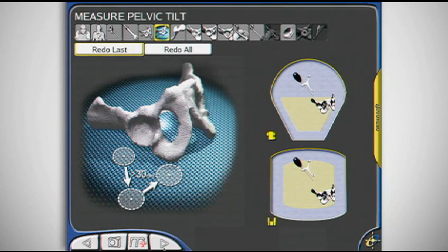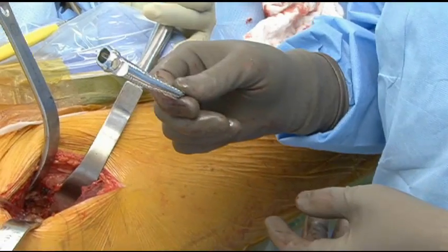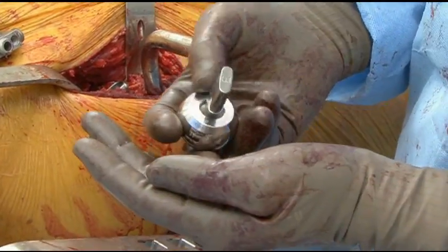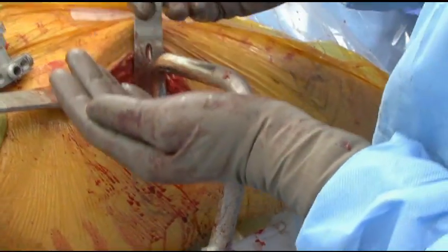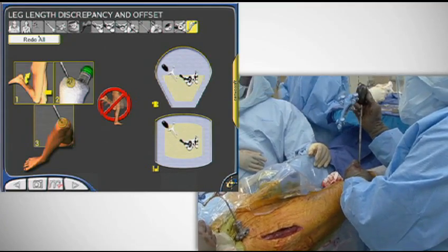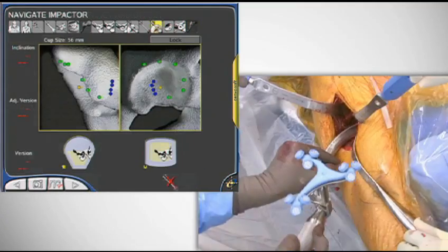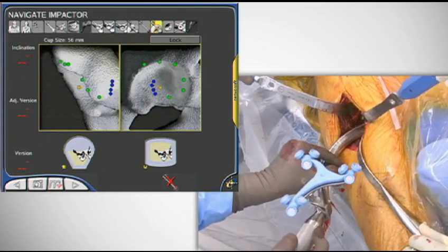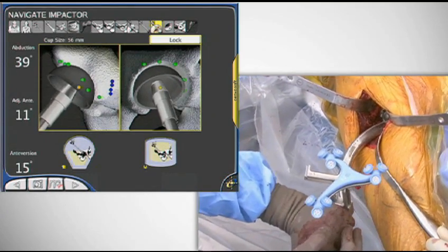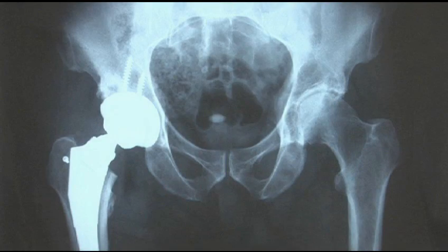The MIS anterior supine hip procedure featuring CAS navigation and the Zimmer ML taper with connective technology follows a single incision approach that is muscle sparing to total hip replacement. This technique replaces the hip through a natural interval between muscles and nerves and maintains complete acetabular and femoral visualization.